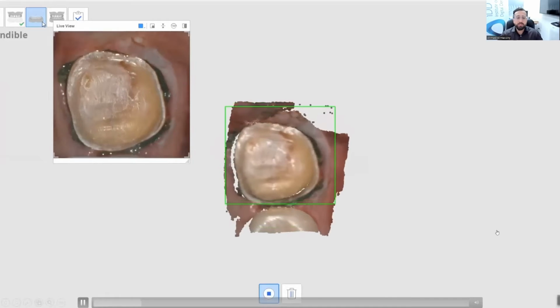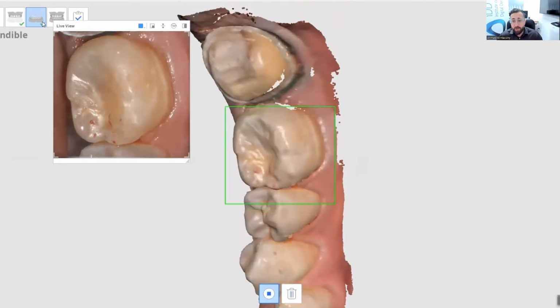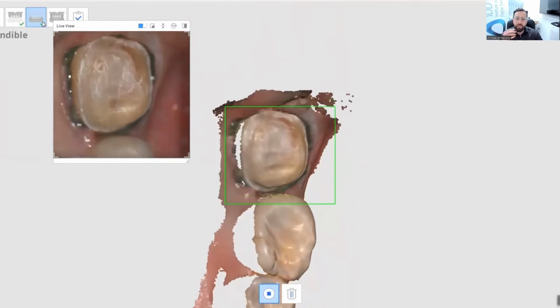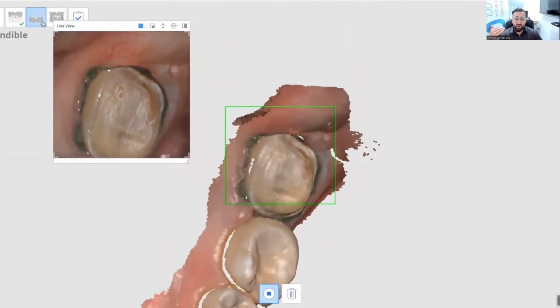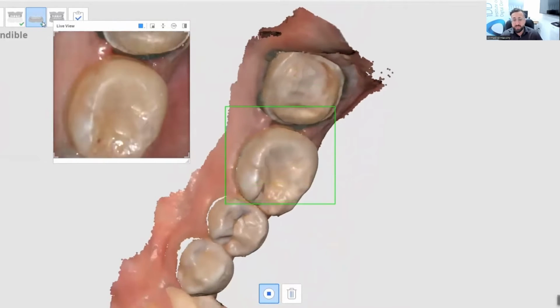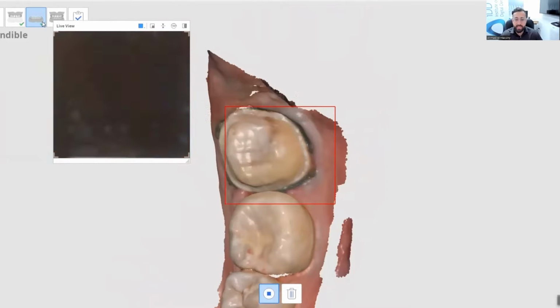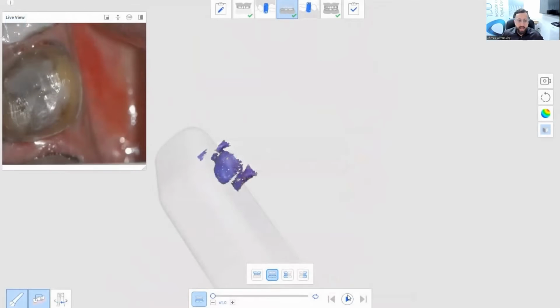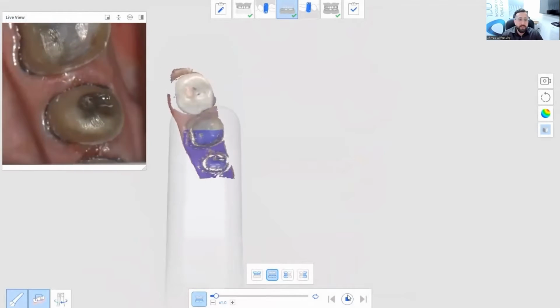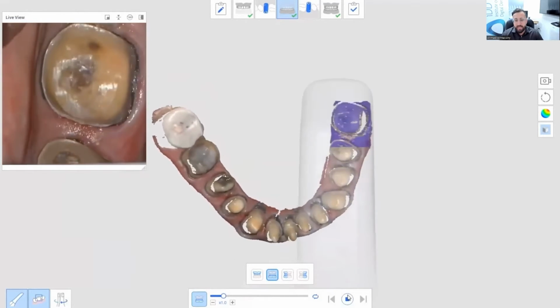And so what you'll see in this video is a very simple scanning video taken live. It's not sped up or anything. You can see this crown preparation being scanned, extremely efficiently. And that's really the beauty of scanners. This is the point that you want to get to with your scanner. You want to get to the point where it's completely seamless and you can do something like this within a few seconds. And once again, I've used my Medit scanner for everything from a single crown to a full mouth rehab, as you can see here.